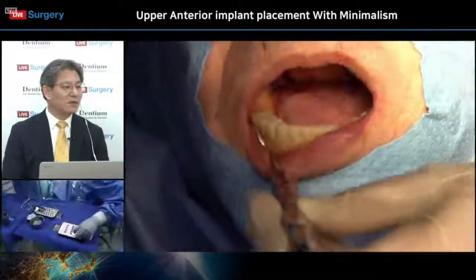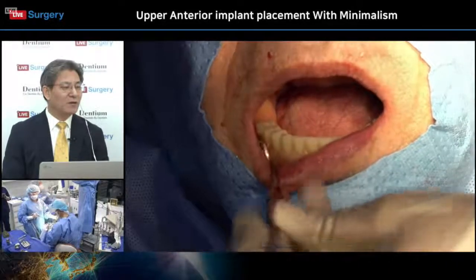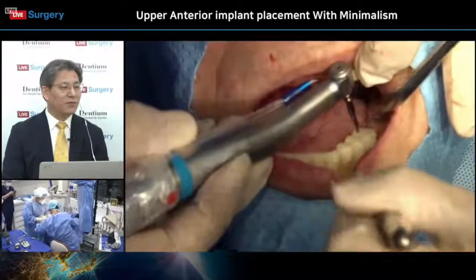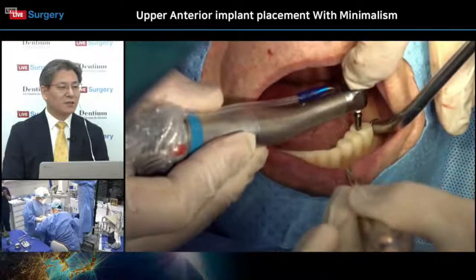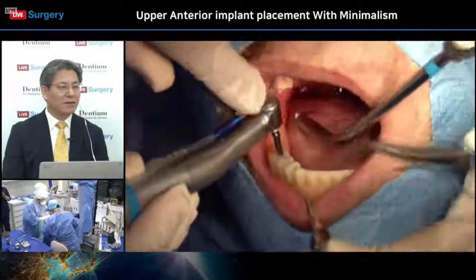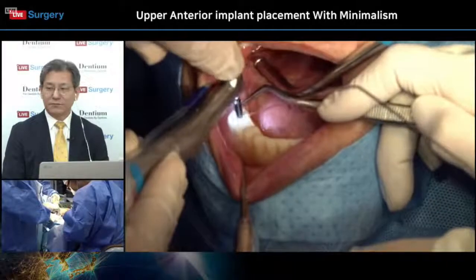Moving to the lower jaw, the posterior mandibular installations. He is preparing the number 46 area for implant drilling after connecting the 3D printed denture. Okay, number 36 first. Yeah, using the guide drill. Now the guide drill is used here, at 1000 RPM.